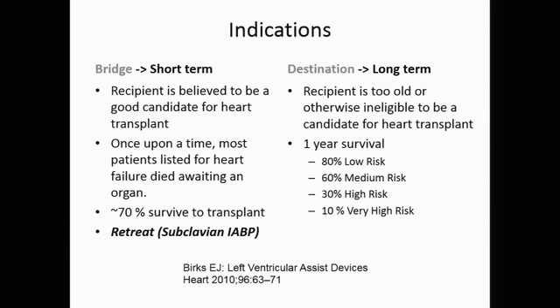The other thing is that the rate of driveline infection is so high, about 40% in patients who have these devices, that you don't want to explant a patient who has a driveline infection, drop a heart in them, and then start them on quadruple immunosuppression. So to avoid that kind of complication, we've gone to putting subclavian balloons on some people. So at my shop, most of the LVADs we insert are what we call long-term devices.